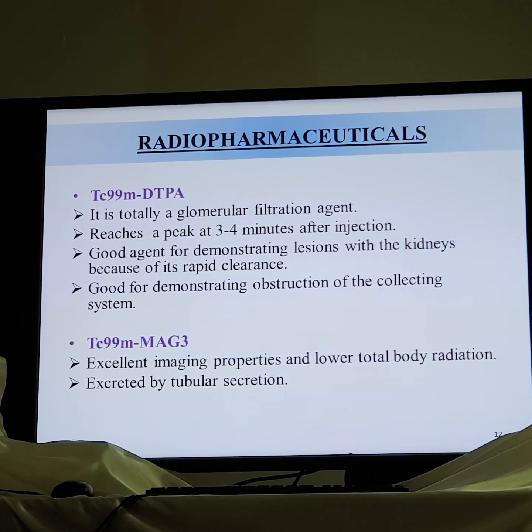It is a good agent for demonstrating lesions in the kidney because of its rapid clearance. It is good for demonstrating obstruction of the collecting system, but MAG3 is better than DTPA for demonstrating obstruction.